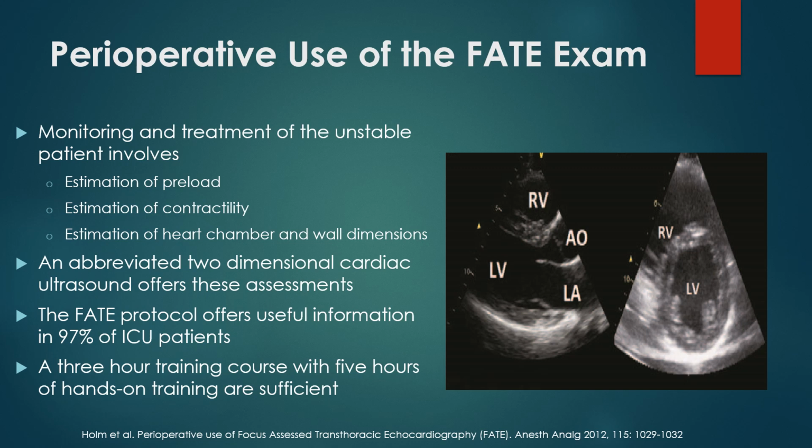So if you know that the blood pressure is down and you look and see that the contractility and the preload are down, you know to give either volume or a little bit of contractile drug, ephedrine. If everything looks good with your preload and your contractility, maybe it's time to give an SVR drug. It can be as simple as that if you want.